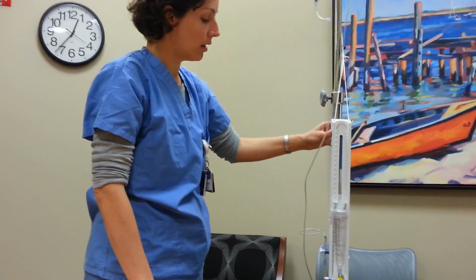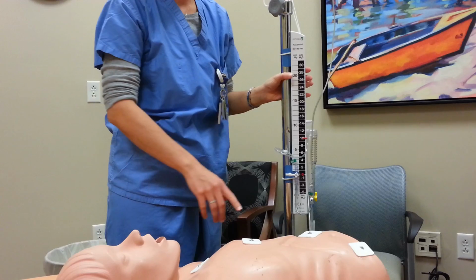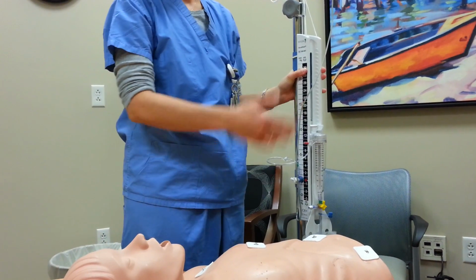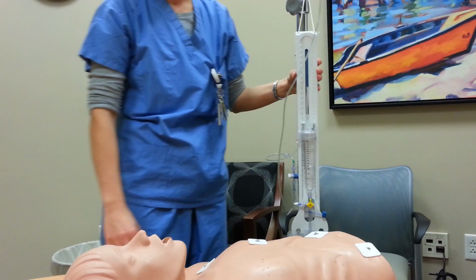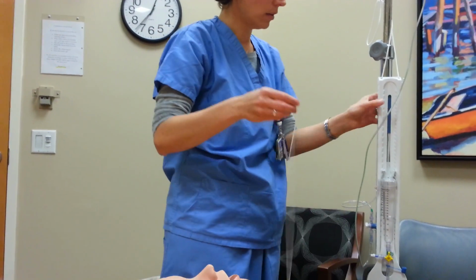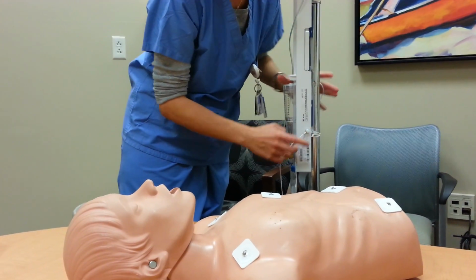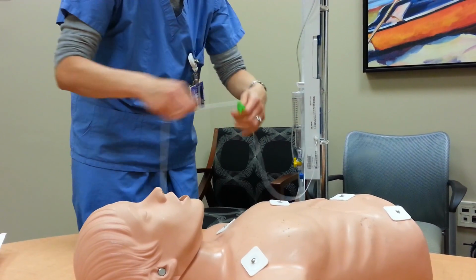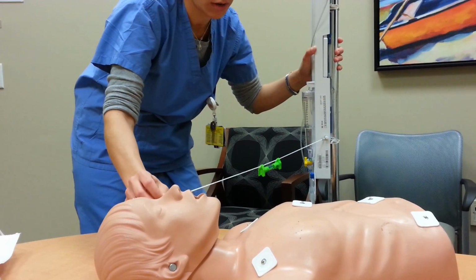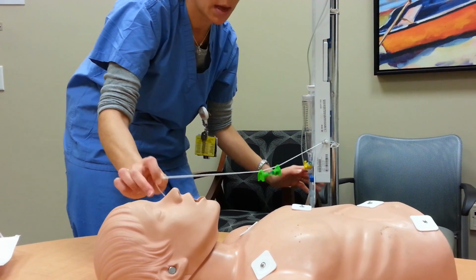As Justin mentioned, the level of the ventriculostomy drain in relation to the patient's ventricles or their level to their tragus is important for overdrainage and underdrainage. Inside the box will come a level. It's a small carpenter's level. There's a spot on the side to attach the level to. You push it in, and you simply bring it and make sure it's level to the patient's tragus. In this case, I would need to pull it down a little bit to make it level to this mannequin's ear.